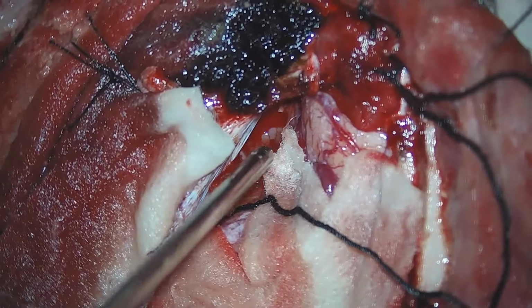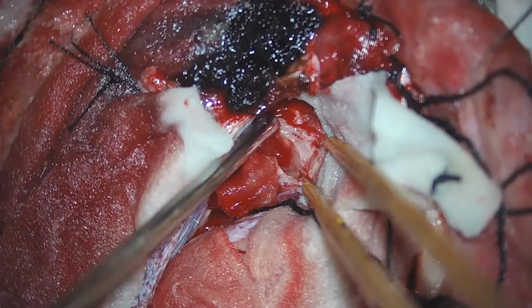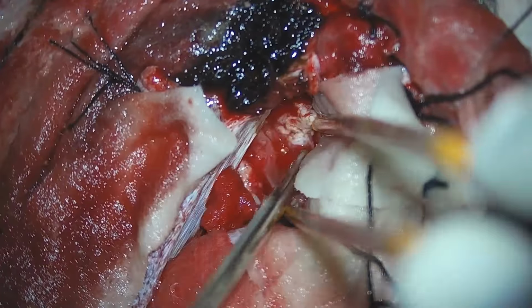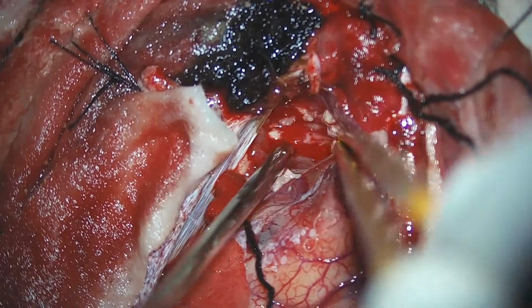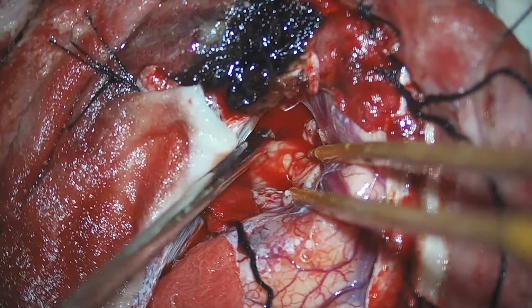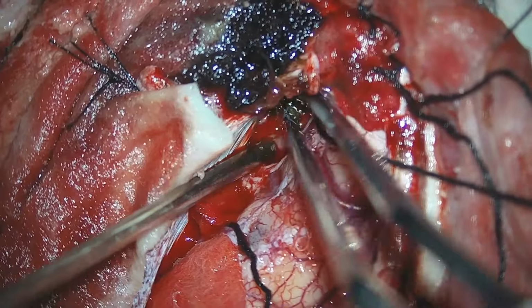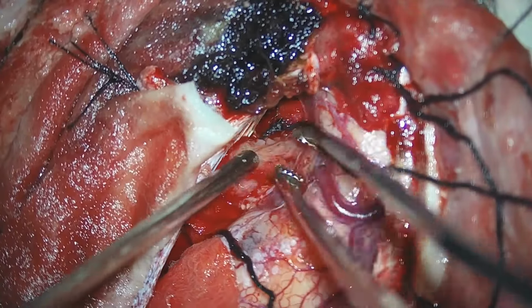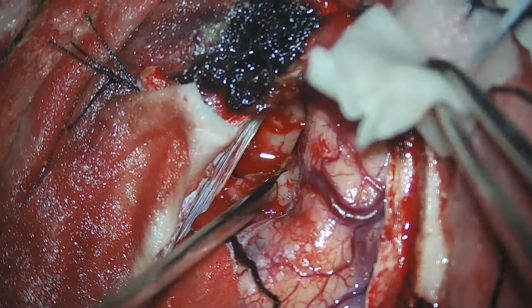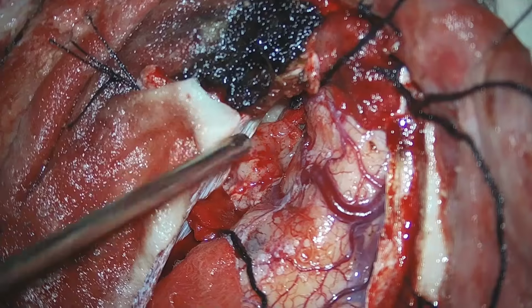After entering the tumor, we start dissecting it out bit by bit and aspirating it with the suction, and we enter the core of the tumor where we can see some necrotic area. We slowly use cotton pledgets to achieve hemostasis and start debulking the tumor. Our surgery mainly concentrates on debulking of the tumor, and we use bipolar and tumor holding forceps for removal of the tumor.